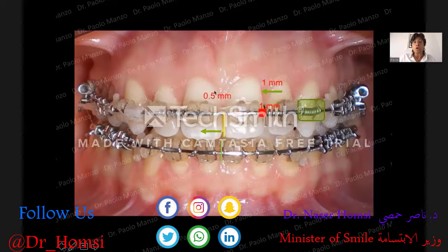And I can also use the power chain here as an active unit. For example, I want to correct this midline 0.5 millimeter, moving the upper midline to the right. So I can move with the power chain, and I can stop it 0.5 millimeter with a coil spring back to the distal of the bracket of the central incisor on the right. And so for the passivization, I use a passive coil spring. For the active units, for the movement, I use a coil spring and the power chain.